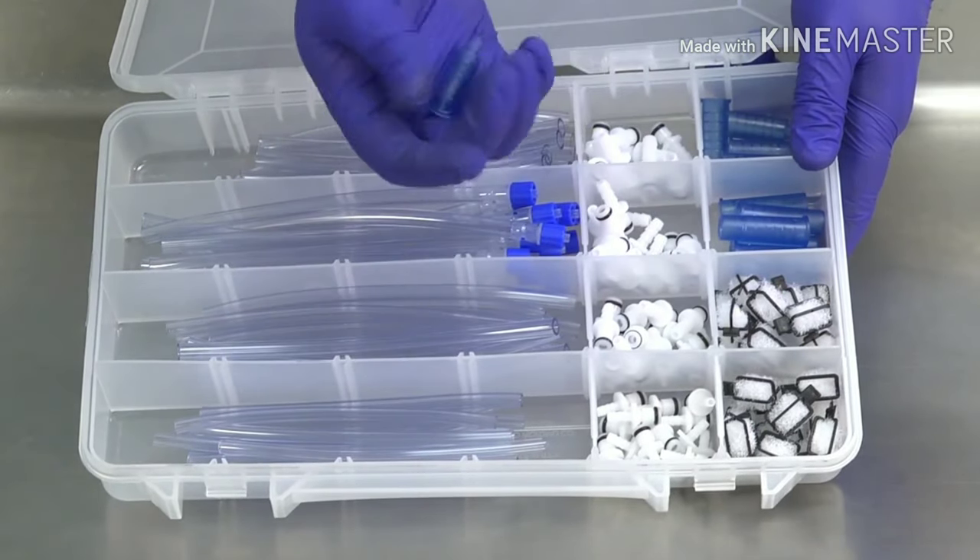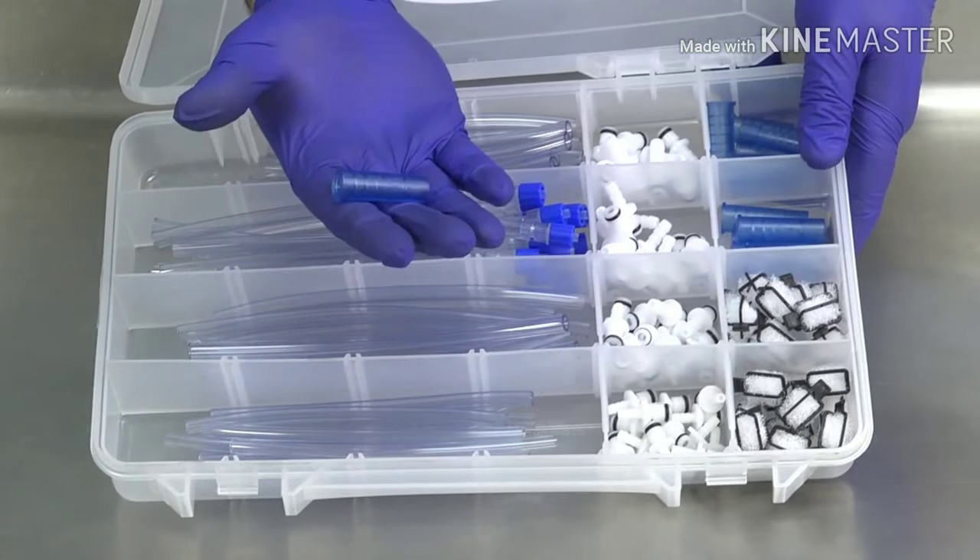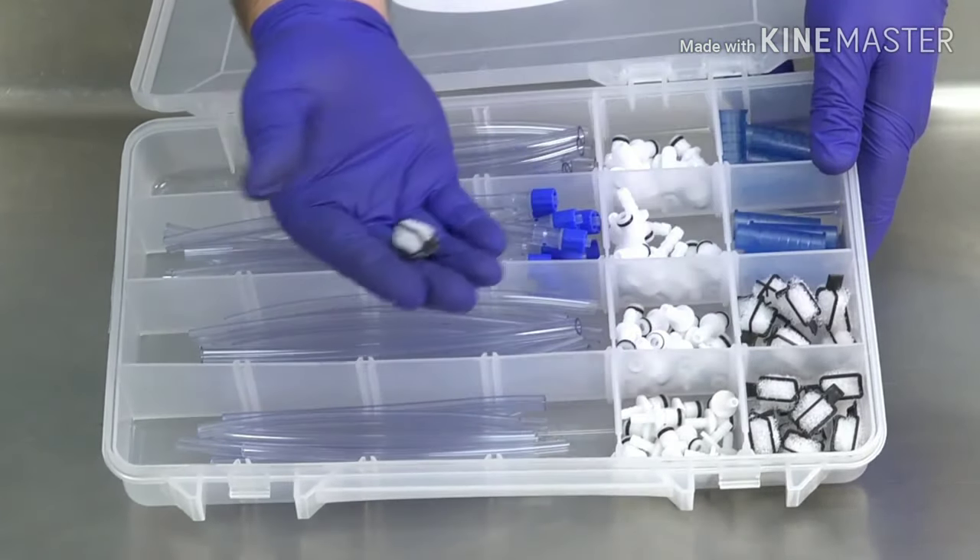The kit also includes small suction adapters, large suction adapters, and a starter set of filters.